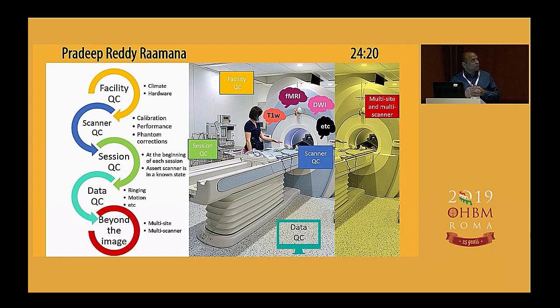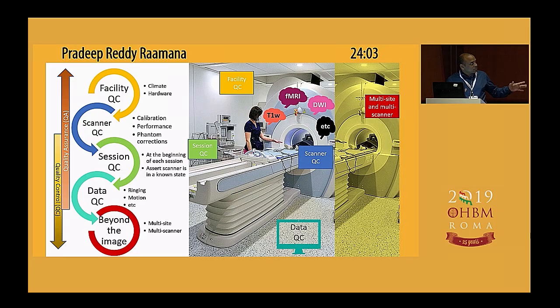So one of the important things you take away from this course, I hope, is that QC is not just what is in the image, but there are a lot more things that go into the fuller framework. And like I mentioned, some of them are more QA and some of them are more QC. They might both be mixed up in some steps.